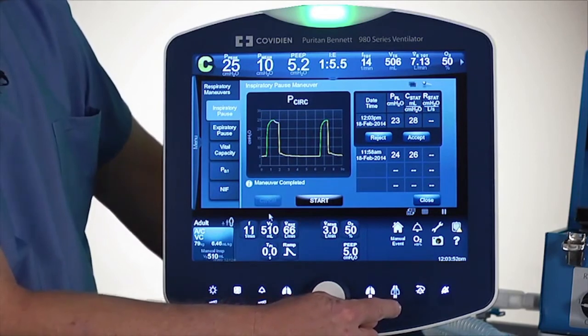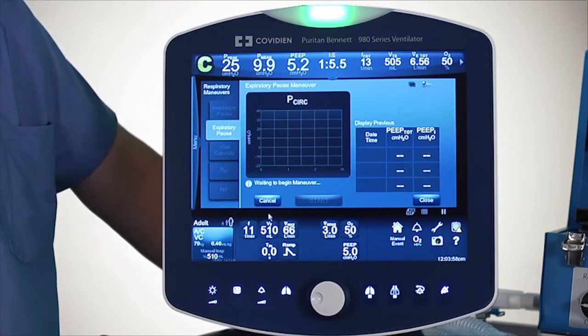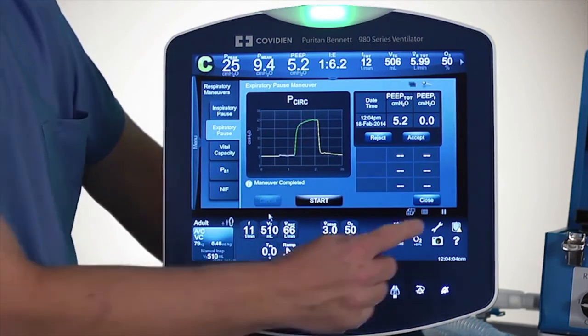Right next to it is an expiratory pause maneuver. I'll just touch that button and it does the maneuver automatically. You decide whether or not it's a good maneuver and whether you want to accept that or not. I'll close that down.